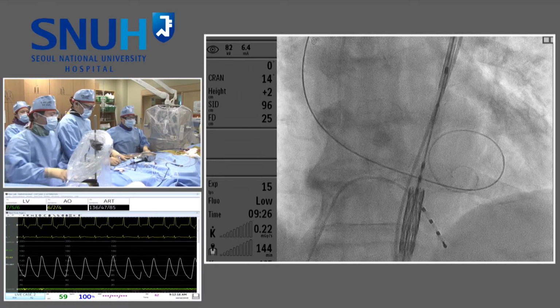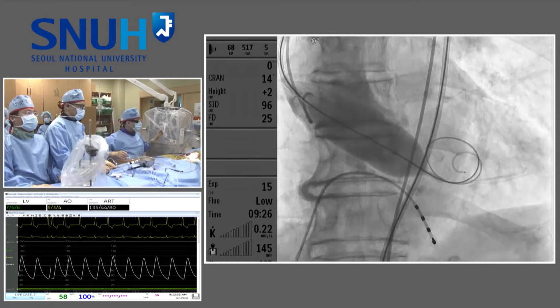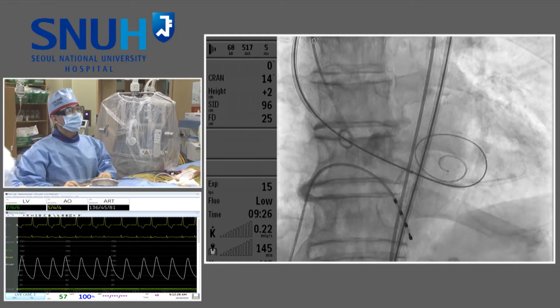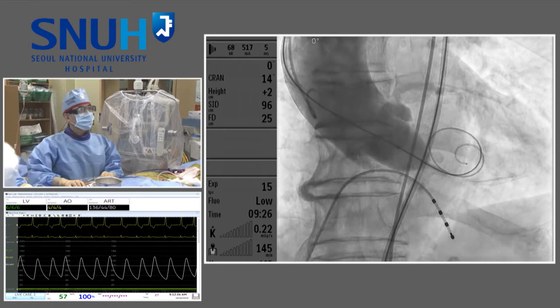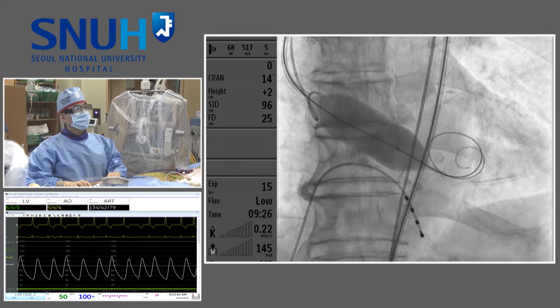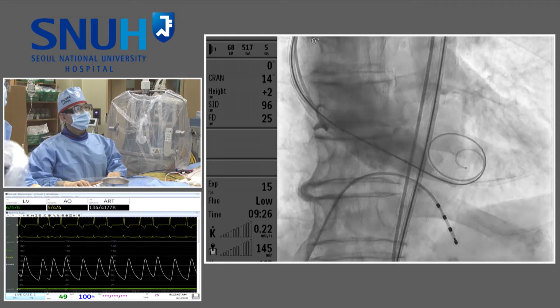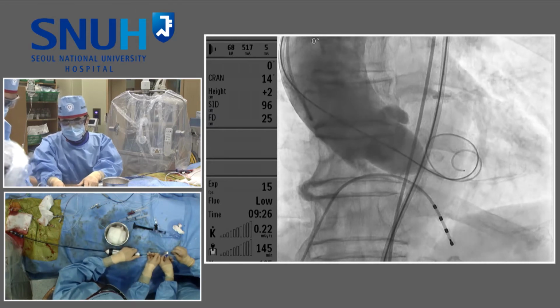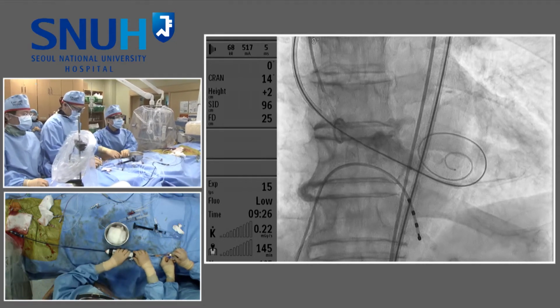Ariel, do you have a concern about coronary obstruction? Well, yes, I am concerned, but I haven't seen the CT analysis, and the CT can tell you exactly before the procedure whether those pieces of calcium that in the angio we see two-dimensional are going in front of the coronaries or not, which I cannot tell right now. But you can see that even though the sinuses are not very small, the chunk of calcium is almost obliterating it. So if it is in front of the coronaries, it is dangerous.